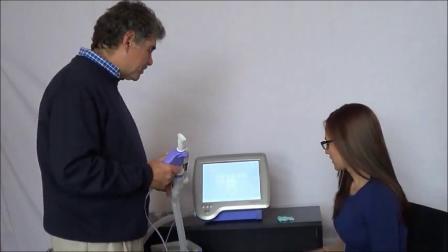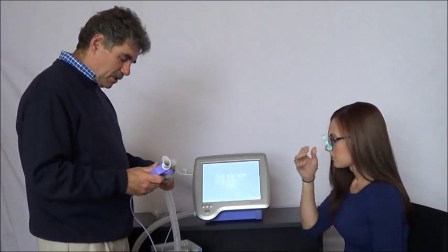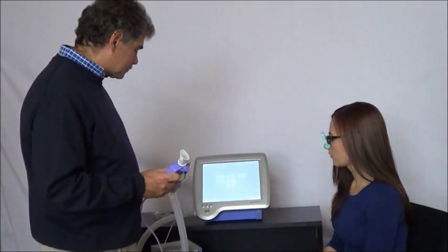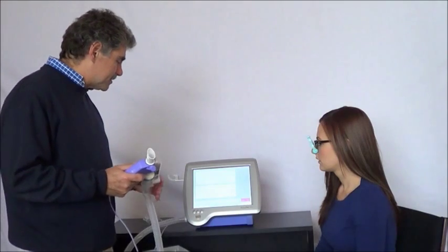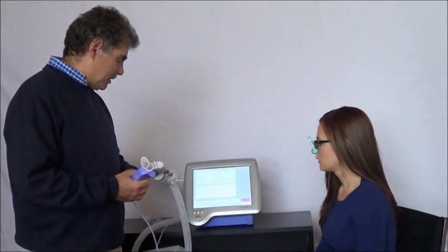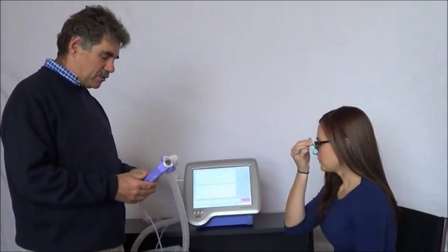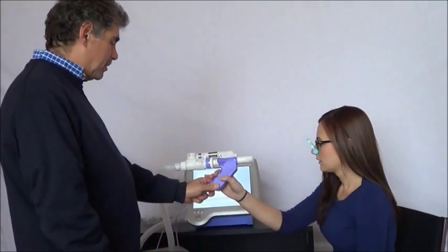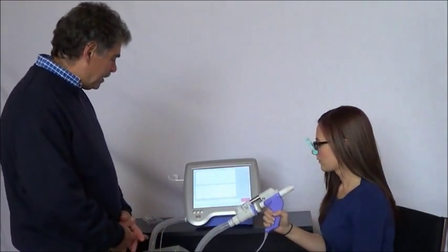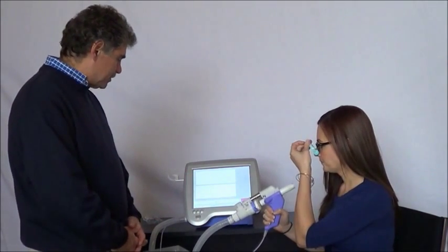We need a nose clip for this test, and we're going to choose DLCO. In preparation for the test, the device goes through a series of checks — a little bit of valve movement, a little bit of flushing action — all that's normal. I'm going to hand that to Bianca while that's happening. We need to wait until the device is ready. Gas flushing now is the message — test preparation.